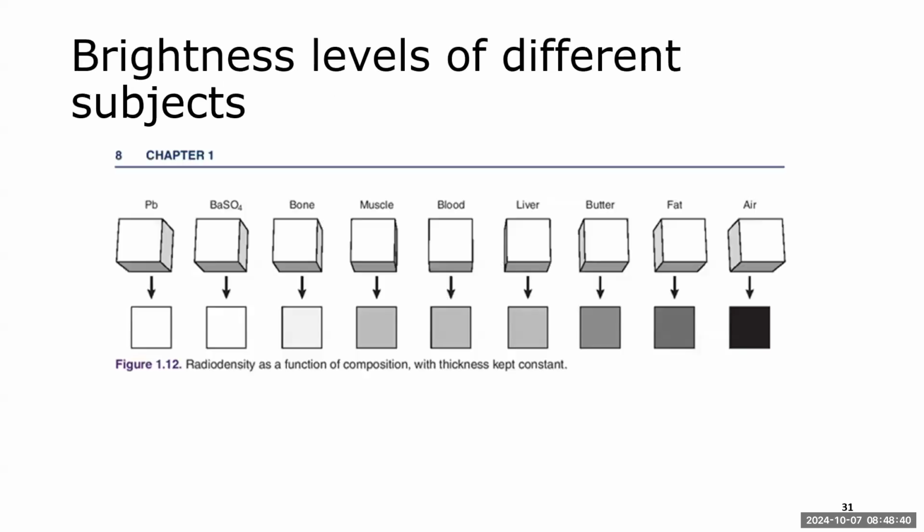So that is where we're going to head here in just a second, is contrast media. How do we use contrast media to help us see different areas that are maybe really, really low contrast areas, and we wouldn't be able to distinguish structures from one another without it.